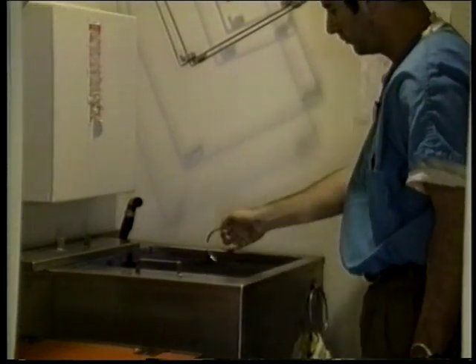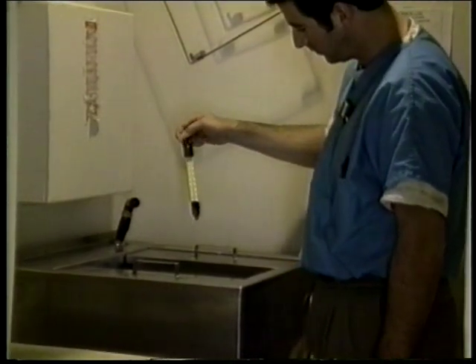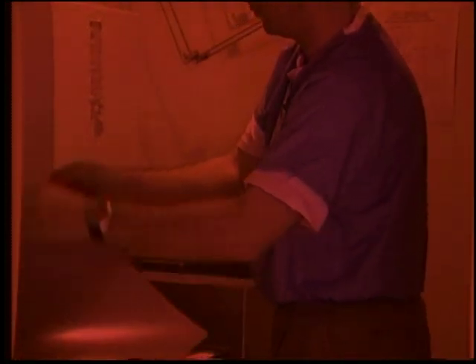The temperature of these tanks is important and should be evaluated prior to turning out the lights. This temperature will determine how long the film will take to develop. With only the safe light on and with hands clean and dry, we are now ready to begin.